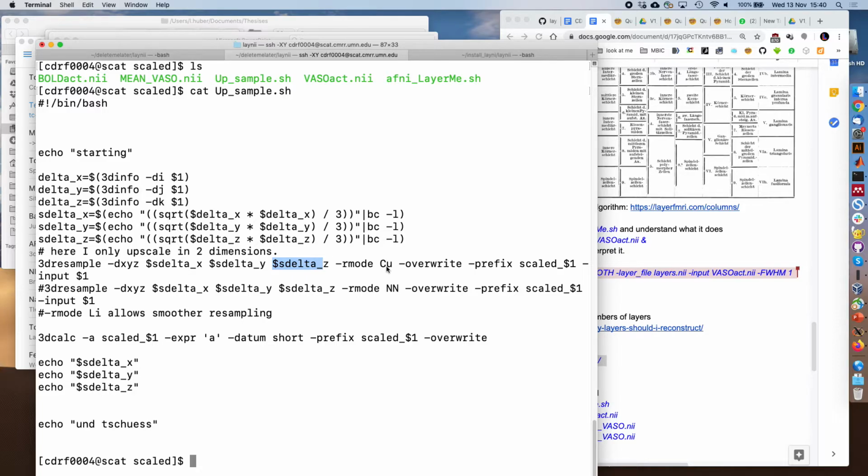If you view the way we acquire the data in k-space as not voxels, but data points on a rectangular grid, we have a voxel centroid and a value of that voxel. I don't think we can assume that we have rectangular cubes that have a certain value. K-space doesn't work that way.